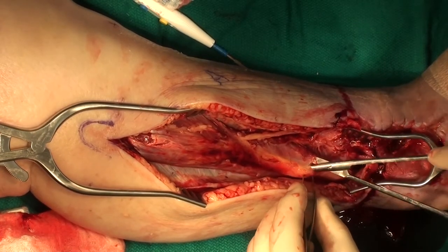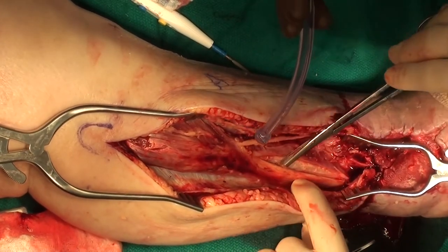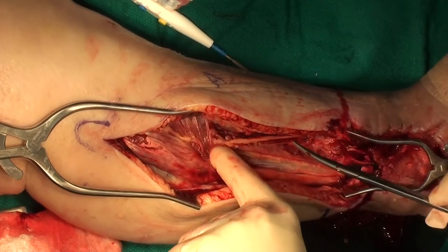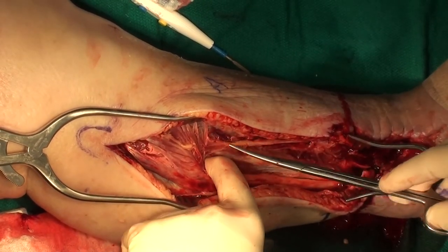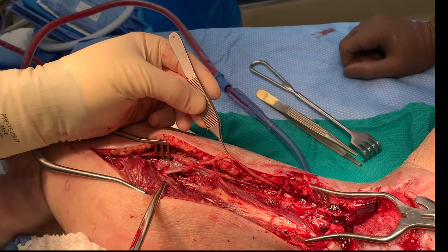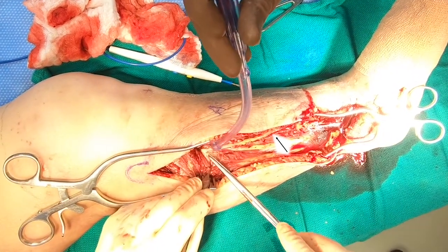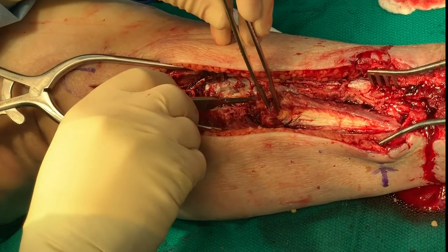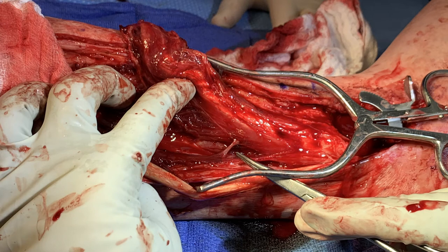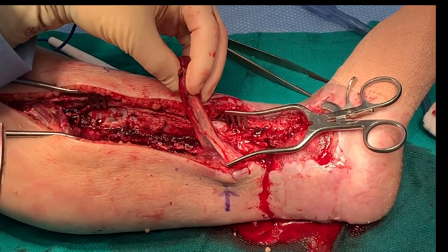We separate the peroneus longus from the underlying peroneus brevis with a combination of blunt and sharp dissection as needed. We can easily distinguish the two muscles distally in the more tendinous portions. Once the two muscles are identified, they separate fairly easily. At the proximal end of the lateral compartment, we identify the motor branch to the peroneus brevis as it branches off of the common peroneal nerve. We section the motor branch, being careful not to injure the superficial peroneal nerve. Once the nerve is sectioned, the superficial peroneal branch is freed and protected as it runs anteriorly in the lateral compartment. The peroneus brevis is then sharply elevated from the lateral border of the fibula from proximal to distal. As small perforators are encountered during the elevation of the muscle, they are cauterized or ligated. As few perforators as possible are ligated to allow mobilization of the peroneus brevis as needed depending on the distance to and location of the recipient site.